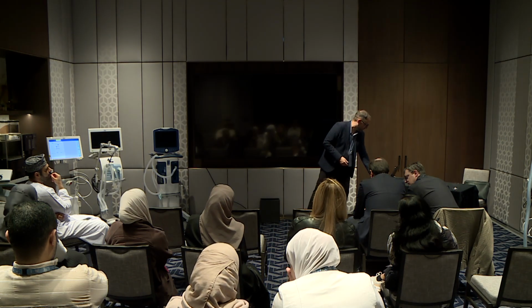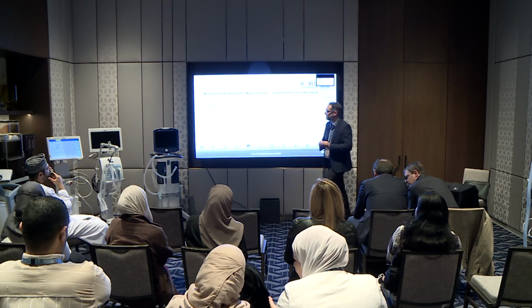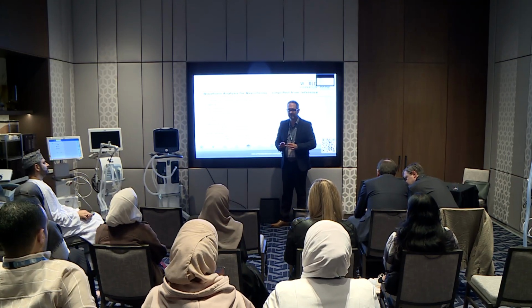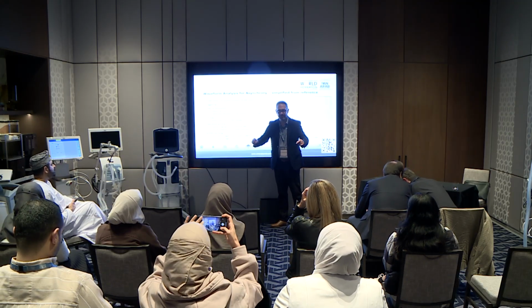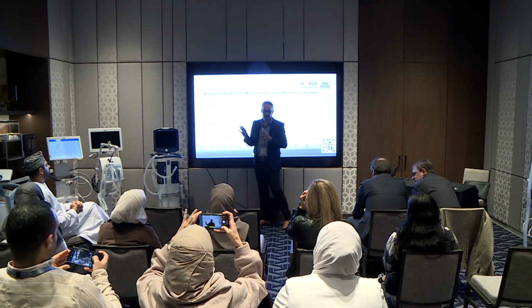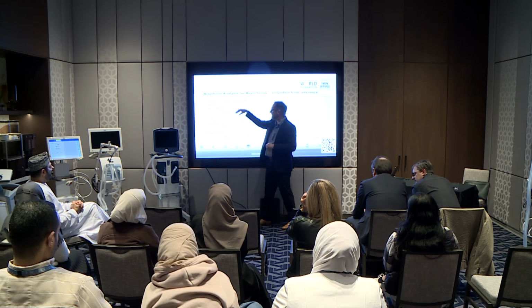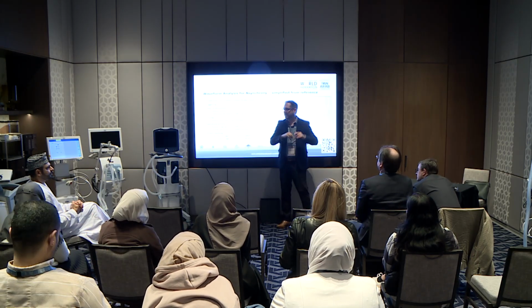Okay, we're about ready to vote. So just to review how we're going to analyze these waveforms, understand the control variable. I don't think I have any trick questions. If it doesn't say the mode on the screen, I will tell you what the mode is. And then you have to determine which waveform is going to show evidence. So triggering is very easy to look at. But when you look at the level of assistance, you're looking for evidence of PMUS based on the control mode, which you'll have to decide which one you think is changing.